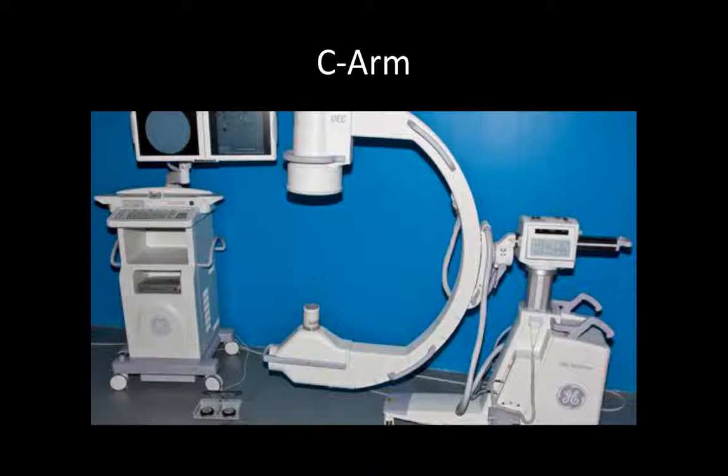What we have here is a mobile C-arm, which I'm sure you guys have used before. They have certain ways of hooking this up. What our departments normally do is, from the monitoring system here, you plug in the C-arm first with this cord, then you come back to the monitor, plug in the monitor, then turn it on. That button right there. Once you're complete, do everything in reverse. So you'll shut the machine off, unplug it, and then unplug the C-arm.